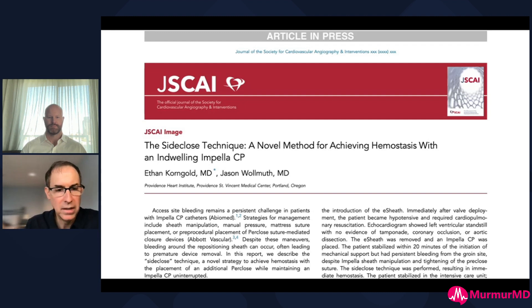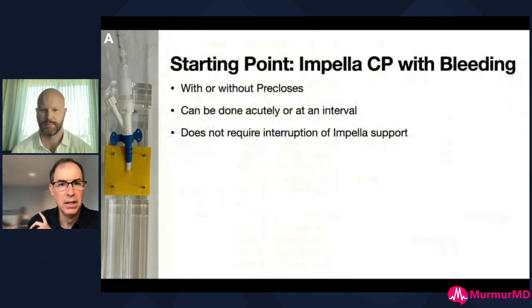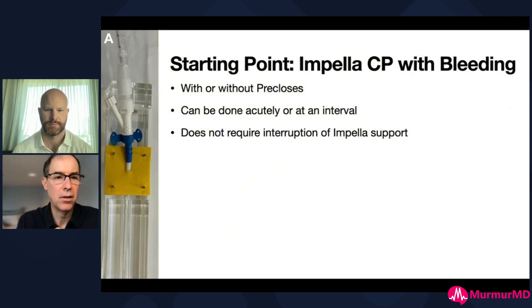He showed me what he did, I've done it several times, and we wrote up a case report in JSCAI. This will walk you through the steps, which we did on a model - we don't have a patient video yet. The starting point: you've got an Impella CP in with the peel away sheath out and the repositioning sheath in, and you're having bleeding around it. The nice thing is this can be done whether or not they have pre-close sutures. Occasionally we'll get patients shipped in from outside facilities who got an Impella CP placed urgently without a pre-close, and this is a great way to manage that. It can be done acutely in the cath lab or down in the ICU without interrupting Impella support.